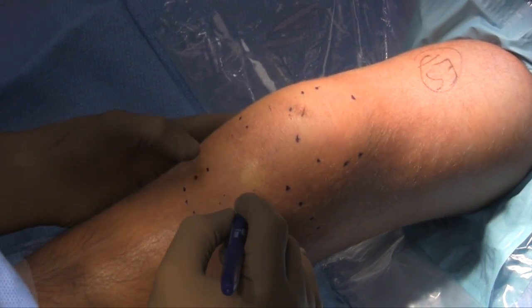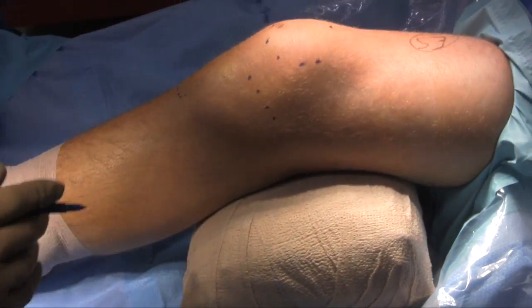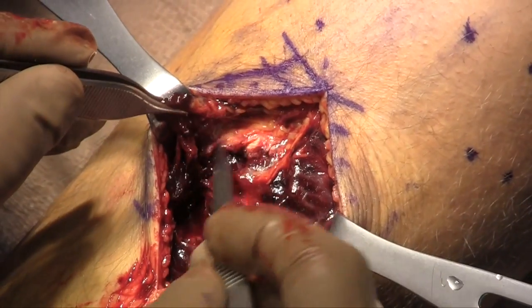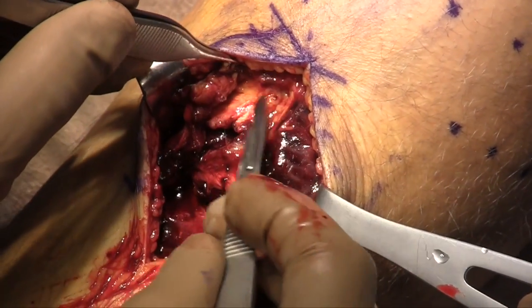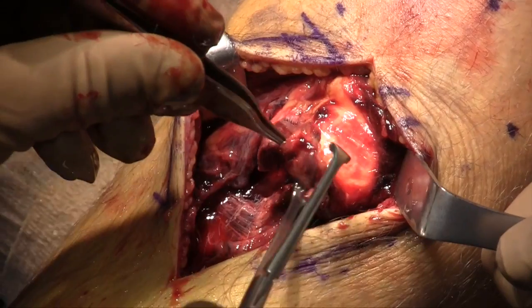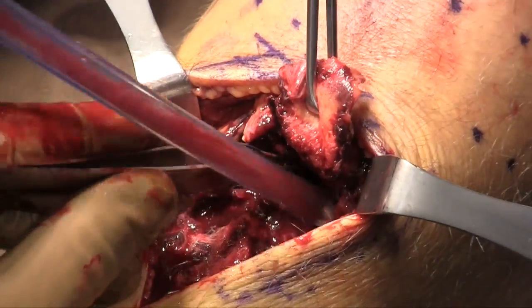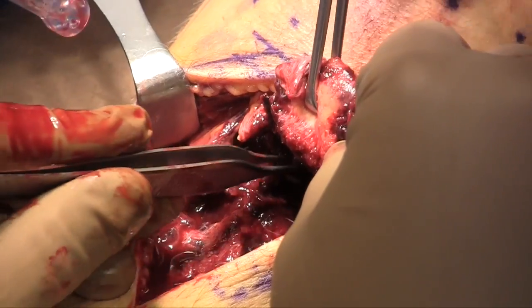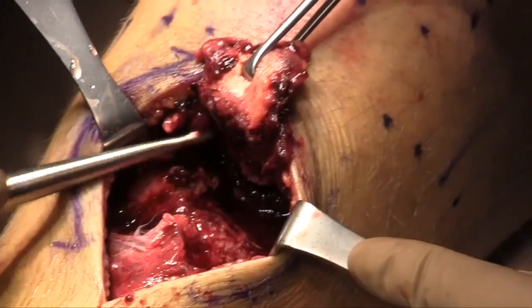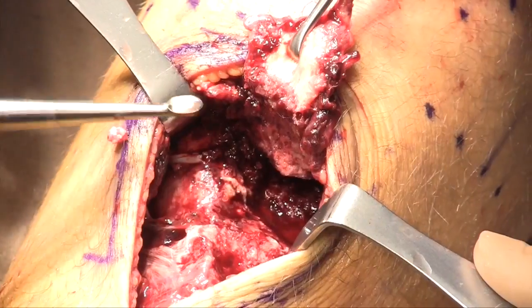Anatomic landmarks including the outline of the patella, the joint line, and the outline of the displaced tibial tubercle were marked out. A midline incision was made and soft tissue dissection was performed down to the level of the fracture site. Flaps were elevated both medially and laterally, further exposing the displaced fracture fragment. The fragment was grasped with an Allis clamp, allowing for exposure of the underlying fracture bed. Fracture hematoma was removed from the site of injury and the area was thoroughly irrigated. Utilizing a curette, the fracture bed and the undersurface of the tibial tubercle fracture fragment were debrided to healthy-appearing bone.